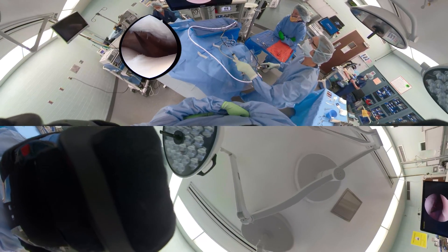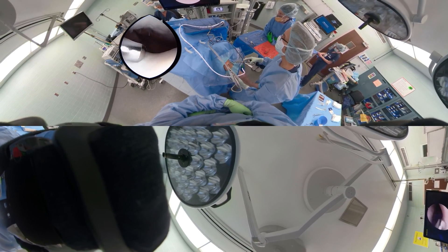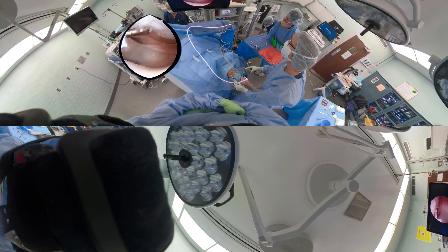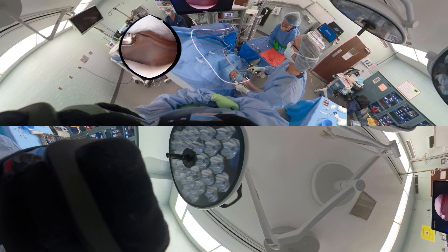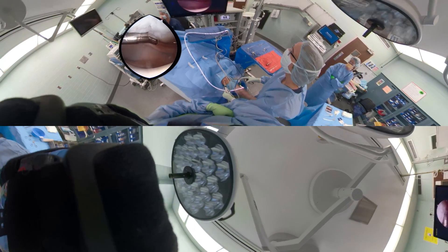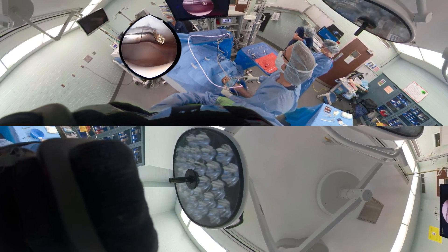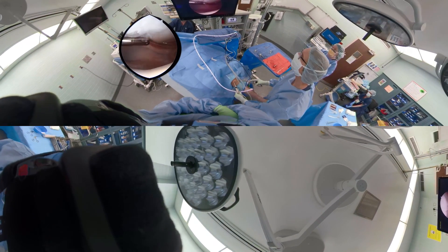This is a curved shaver — if we put it in at the same degree of knee flexion it goes in easily. Make a big enough medial portal so you're not struggling to get your instruments back in. For articular cartilage debridement, we have the shaver on oscillate, coming in perpendicular — not creating any worse defect. Just getting rid of loose edges and hanging tissue, doing a debridement rather than a formal chondroplasty of the patella.